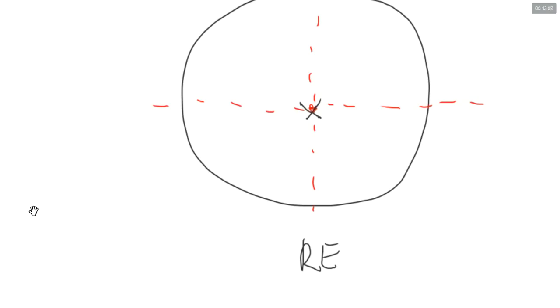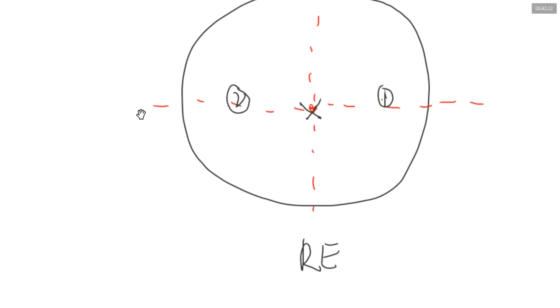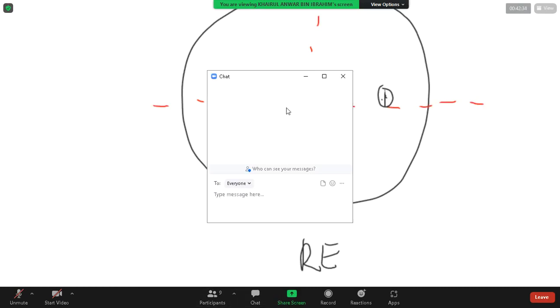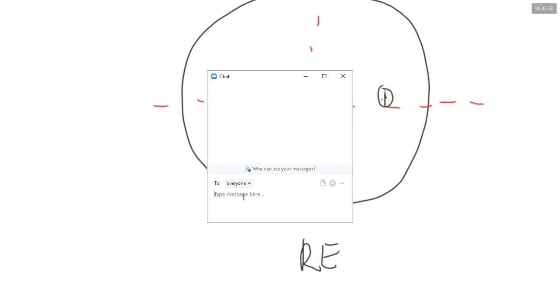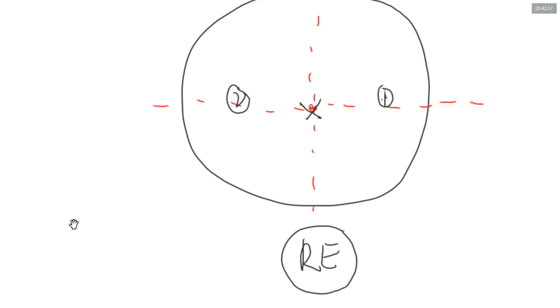As I said before, the macula in relation to the optic disc is usually inferior temporal. So in the right eye, if you draw the optic disc where it should be, over here, number one, or over here? Anyone? Your optic disc will be nasal to the macula. So it'll be near number one, am I right? Yes. Very good, Adil. Your optic disc should be on number one.